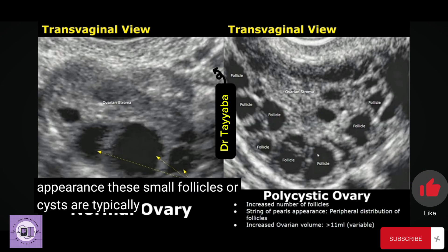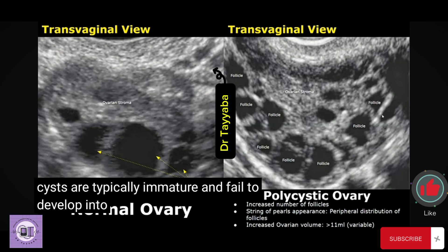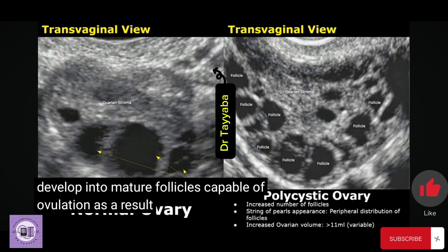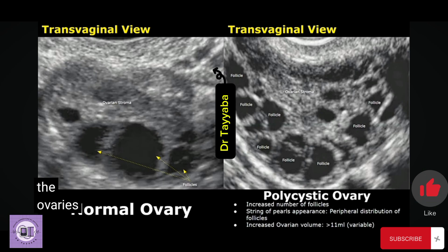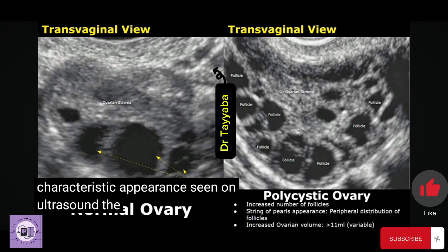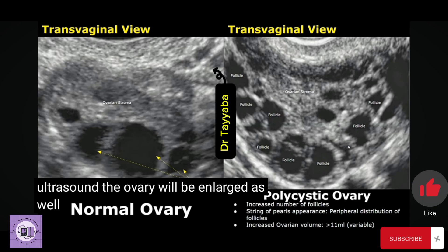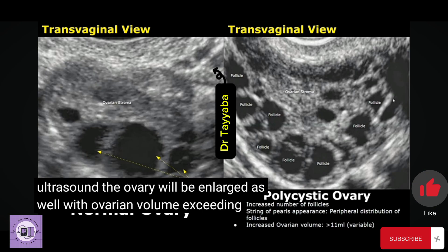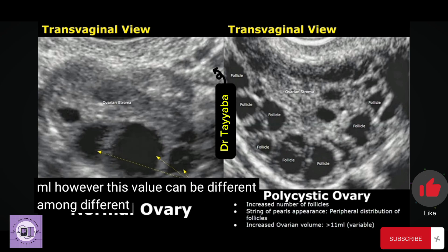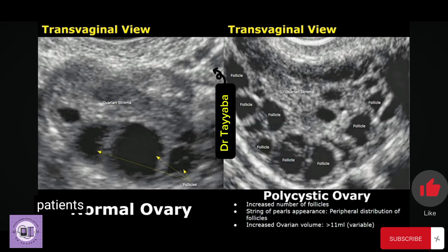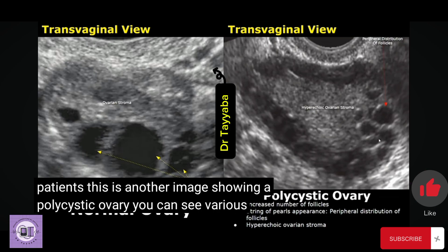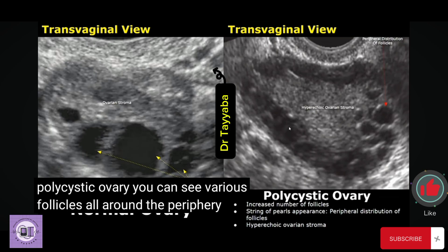These small follicles or cysts are typically immature and fail to develop into mature follicles capable of ovulation. As a result, they accumulate in the ovaries, giving rise to the characteristic appearance. The ovary volume also exceeds 11 milliliters, though this value can differ among individuals.